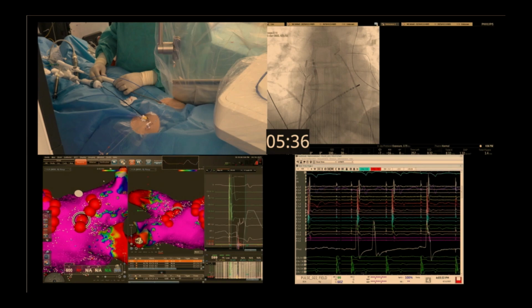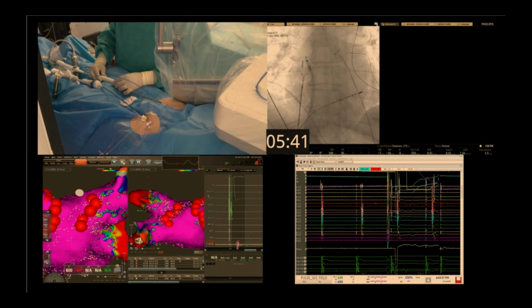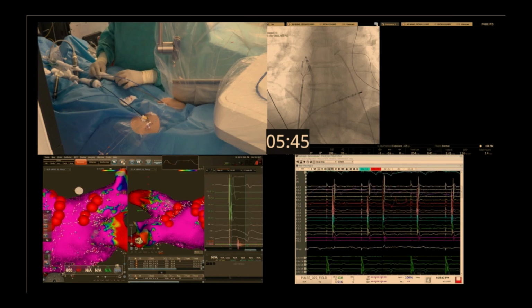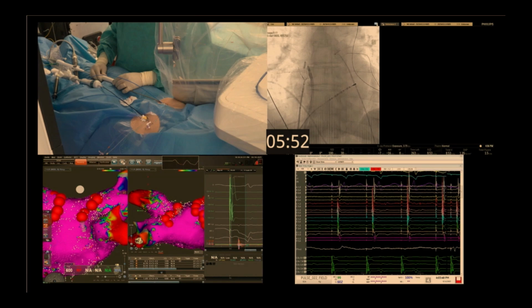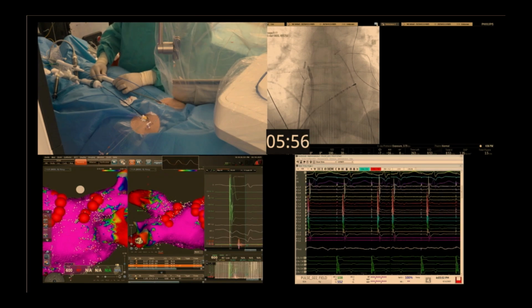So, you just get, here's what you get when you use the nominal dose, right? We don't know what happens when you use less or more. So I think that these kind of catheters are going to be great for most focal arrhythmias or focal ablation. Maybe not AVNRT, but for most of the others. And I think that it's just going to take some time.